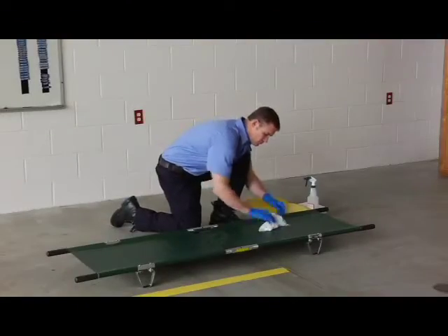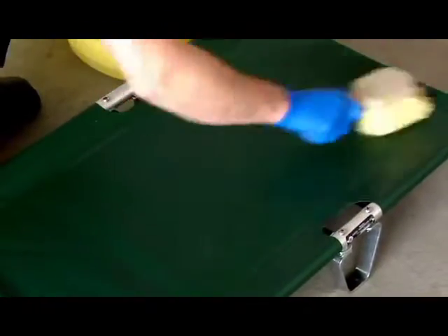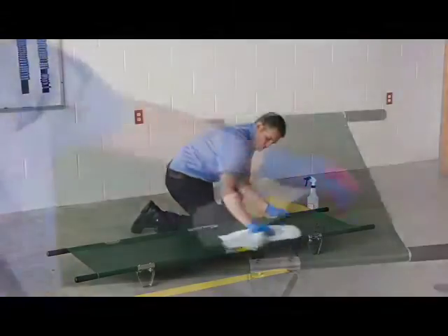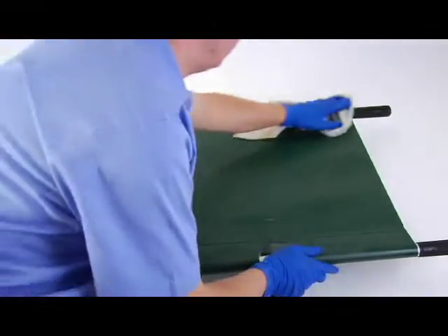Clean all surfaces with warm water and a mild detergent. Use a stiff bristled brush if necessary. Rinse with warm water and towel or air dry. Disinfect all surfaces following the disinfectant manufacturer's directions for use.